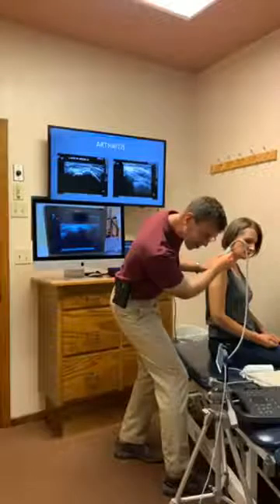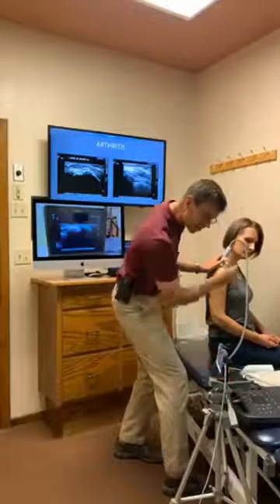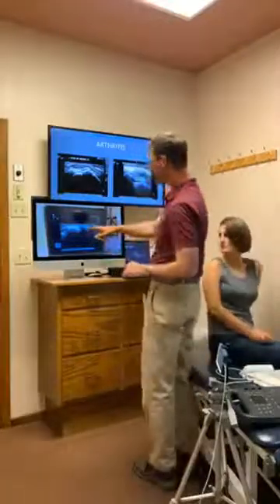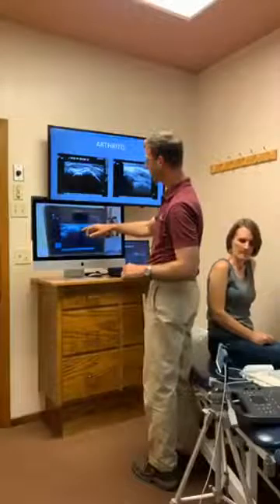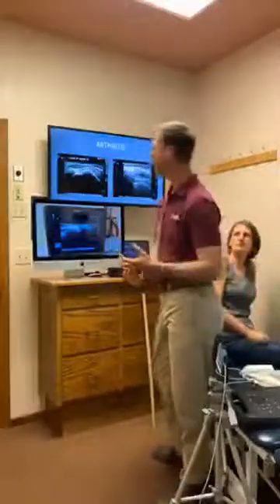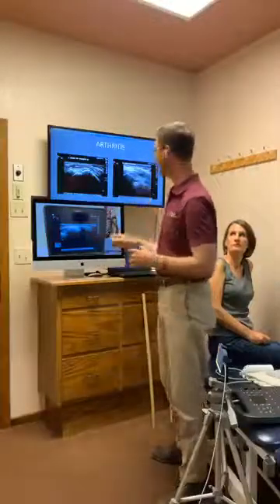All right. So there we have it. Okay, so over here we have the collarbone, over here we have what's called the acromion, and the joint is right here, and we can also see right here, there are supporting structures. You have the ligamentous complex and the joint capsule overriding it. There are times when you see problems, which I think we will see in just a second.